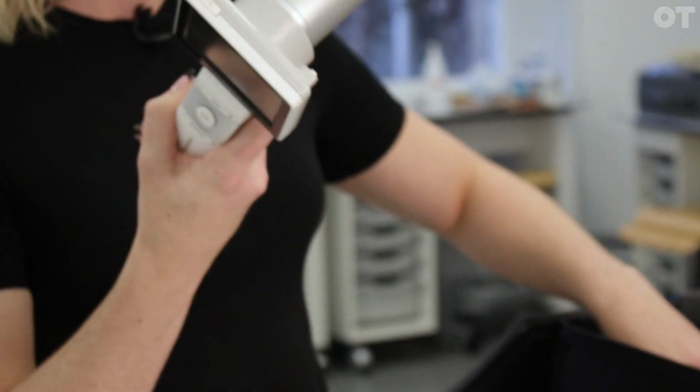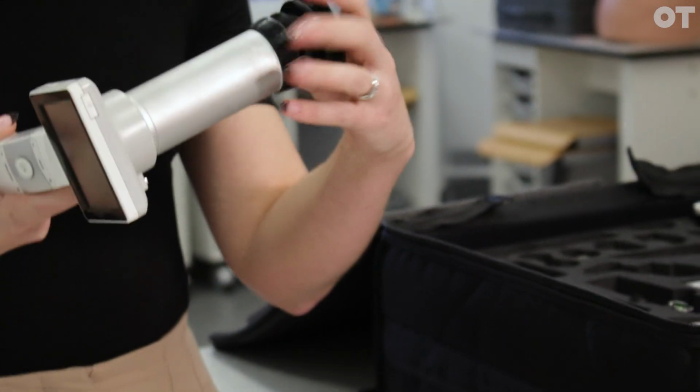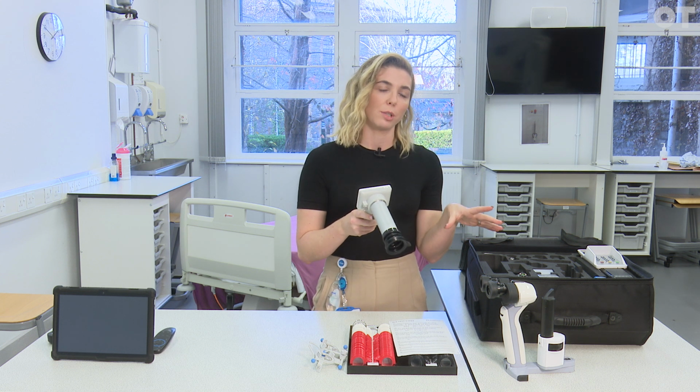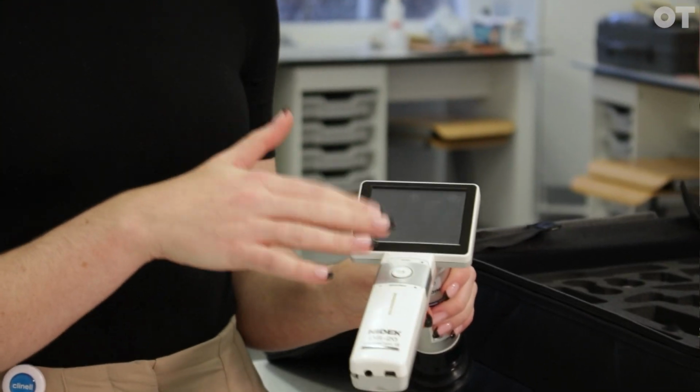We use fundus photography, which is really great. So there's a portable fundus camera that you can use. These are amazing because you can connect them to your tablet. You can monitor people's records. If someone's had a test with us previously and we've got prior fundus pictures, we can compare and we can monitor things over time. Having the pictures in front of you is always really useful.